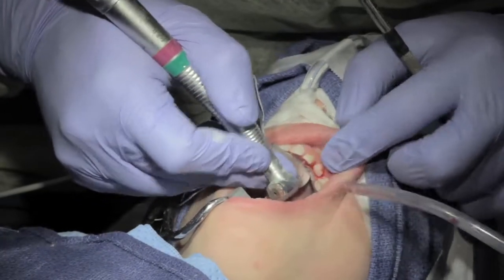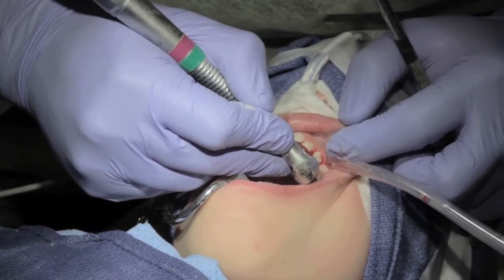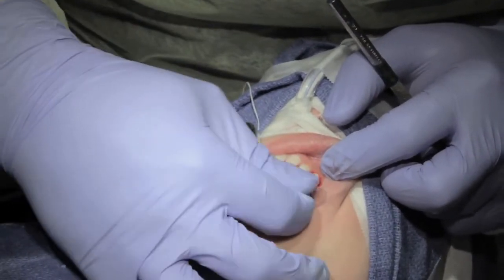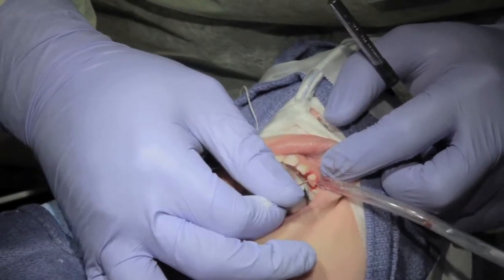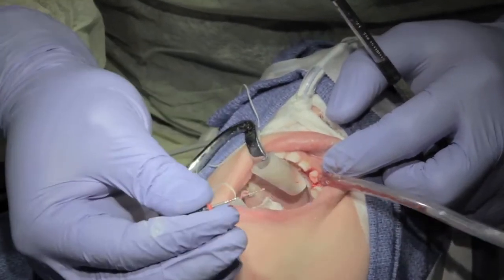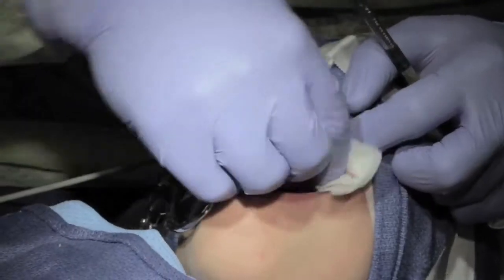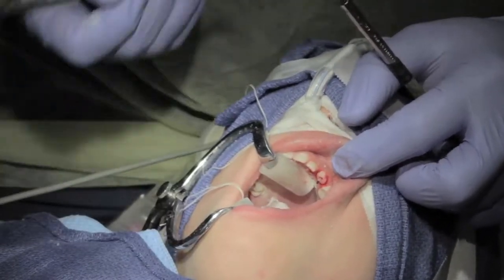Then you do your pulpotomy or pulpectomy access — just come straight in and open that up. Using a size 80 file. The pulp tissue just comes right out. Go in a couple more times to make sure it's nice and clean. Then place a formocresol point and let that sit for a little bit.